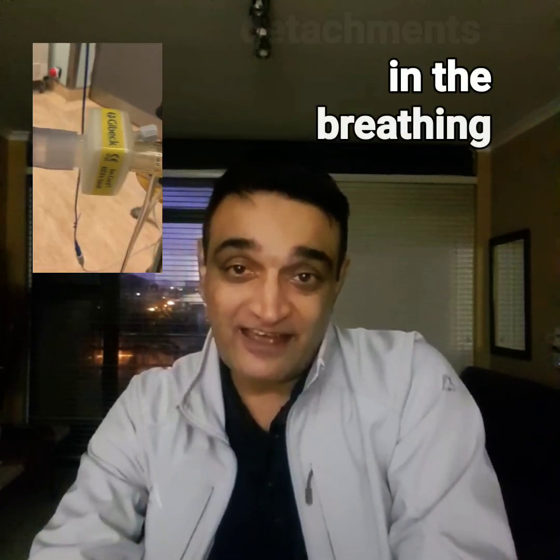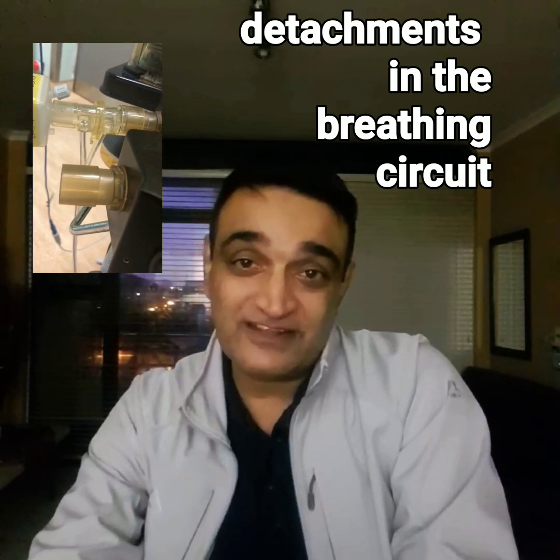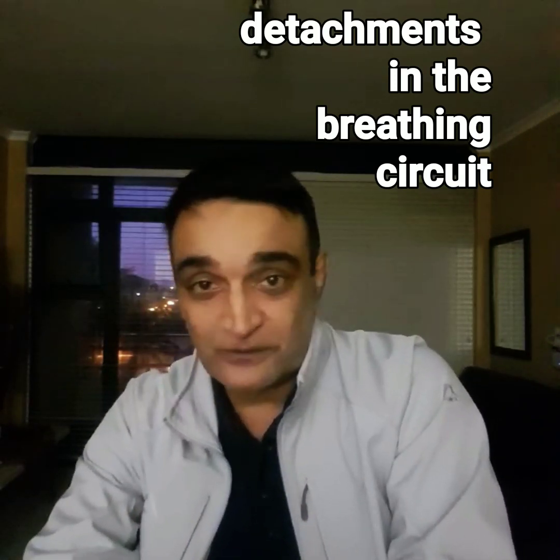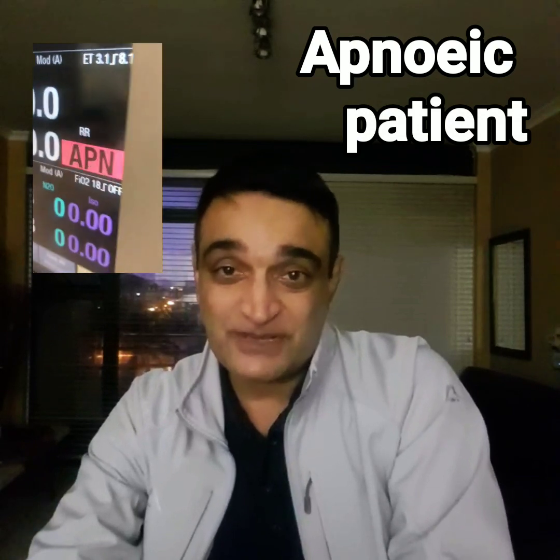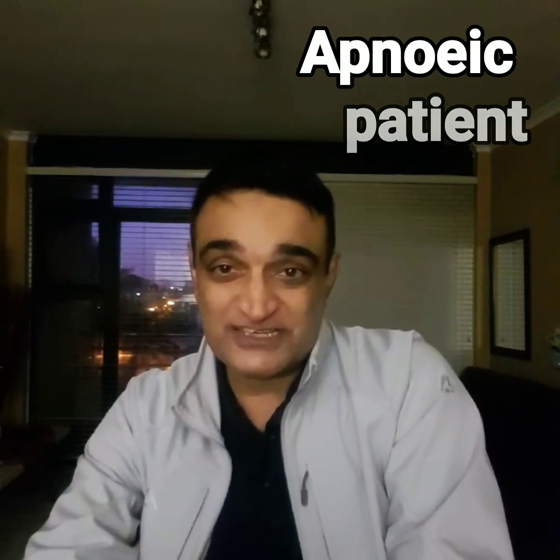The other thing is, the circle system itself can have detachments, and when that occurs, fresh gas flow won't go in and the patient will rebreathe and get hypoxic. And last but not the least, the reservoir bag will also tell you if the patient has become apneic because of administration of opiates. So the reservoir bag is very important. It tells you a lot of things.